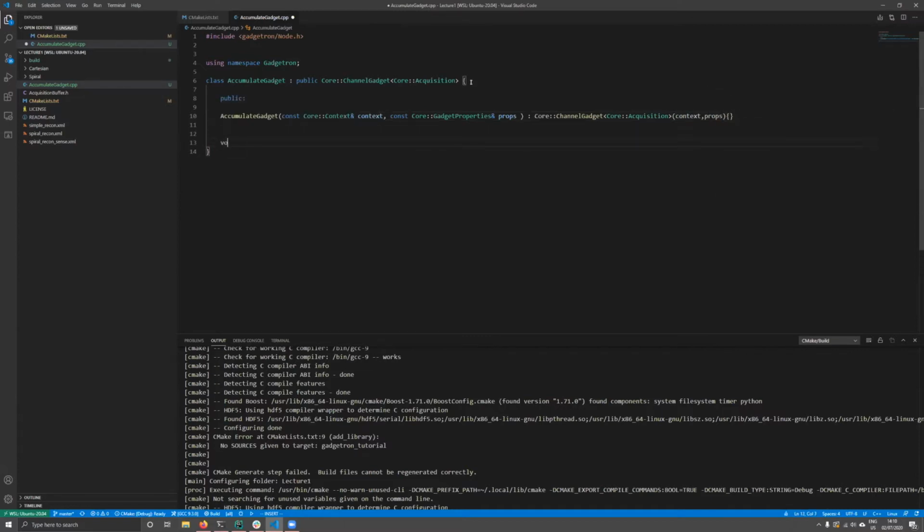So far, not a lot going on. And now we get to the beating heart of every gadget, which is the process function. This is where stuff is actually happening. So it takes an input channel, and we need to tell it what type we are receiving through the input channel, in this case, acquisitions. And an output channel, which doesn't need a type because we can send literally anything. And we'll come back to that in a moment. Finally, we need to add override because we're overriding a function on the channel gadget. So far, so good.